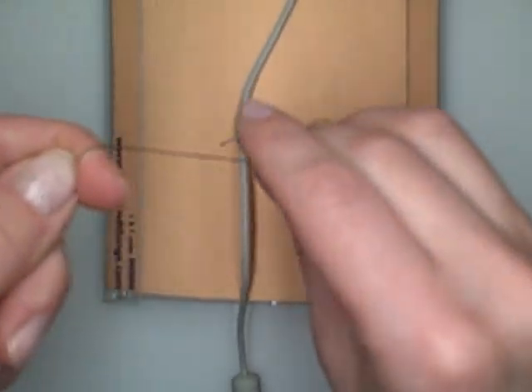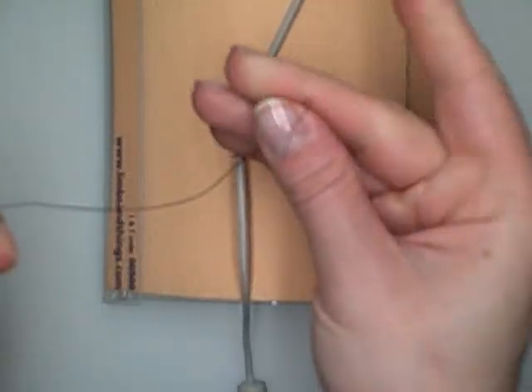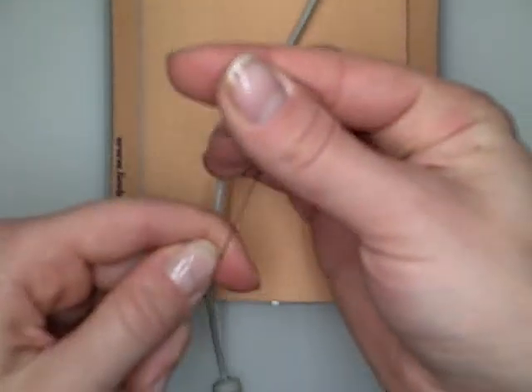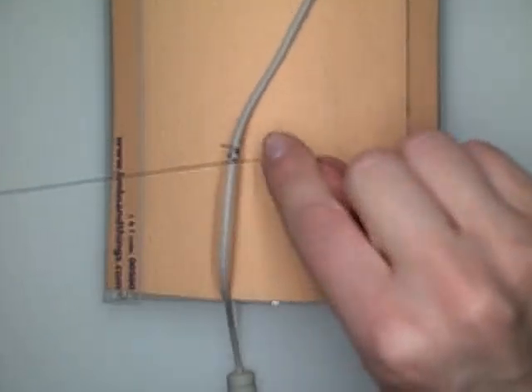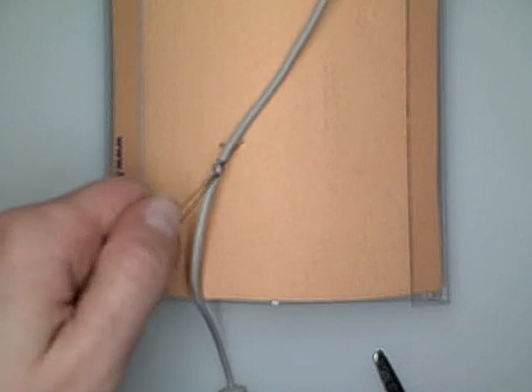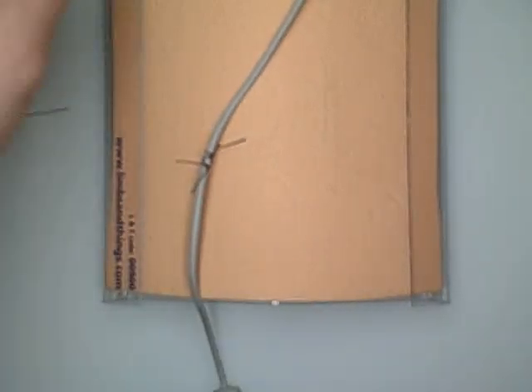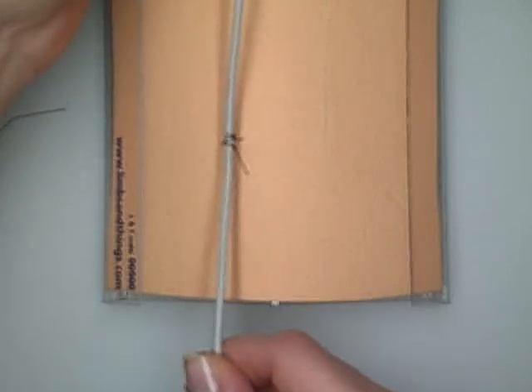Got a really short end — let's see if I can get one more. We're going to leave a little bit of a tail on the end. And you can see this drain is not actually going to move; it's tied into the patient's body.